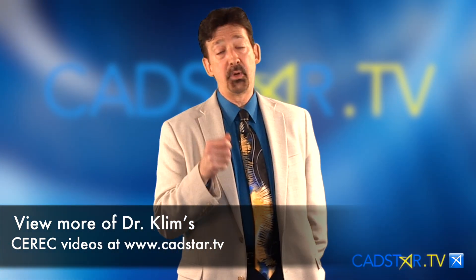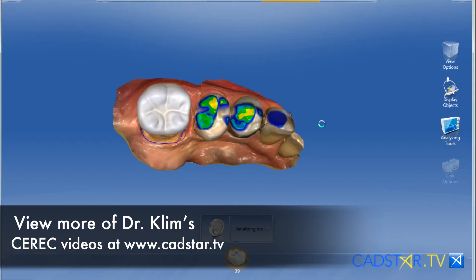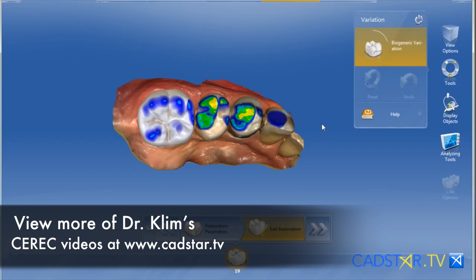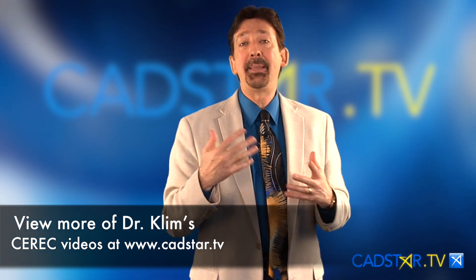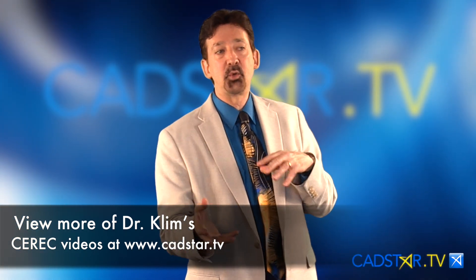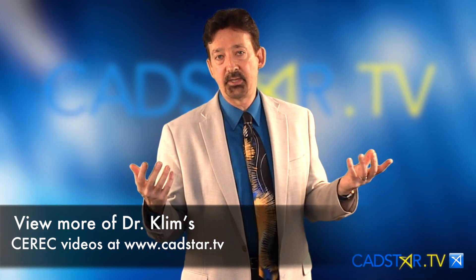You're going to get a proposal that looks pretty good most every time. If you have a good prep situation with a good opposing arch, your restorations look pretty good. Occasionally we'll get a proposal maybe that doesn't appeal to us — it doesn't fit the arch the way we want. How do we change that?